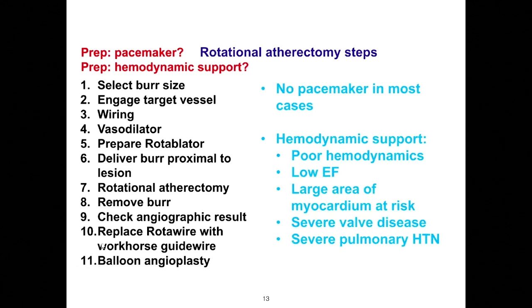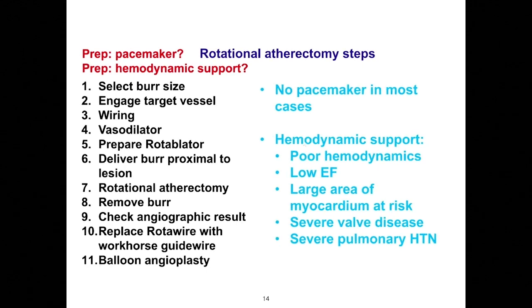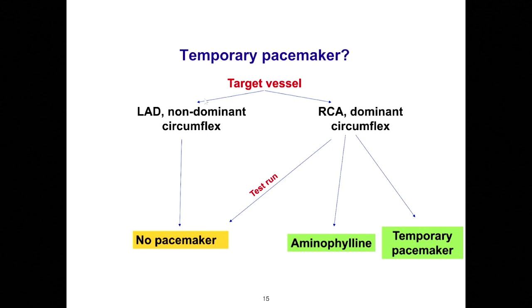And you can also use it for patients who have a large area of ischemia or a sole surviving artery. If you're doing a rotablation of a single surviving artery, then one has to be careful to use some form of mechanical circulatory support in these patients. Temporary pacemaker, as I said, pure LAD, usually we do not use a TPI, but if it's a dominant right or a dominant circumflex, then we would probably use a temporary pacemaker.